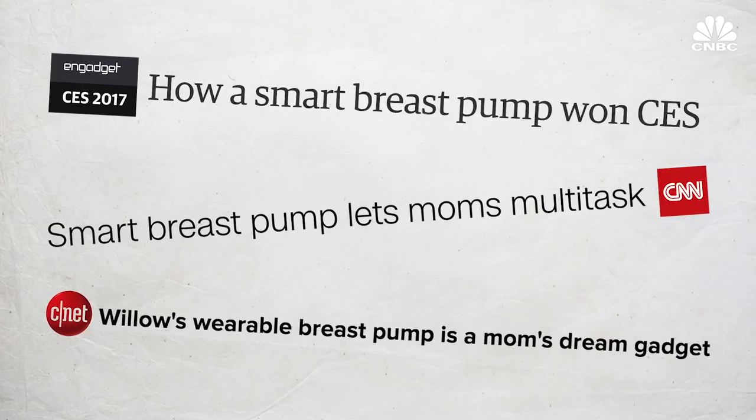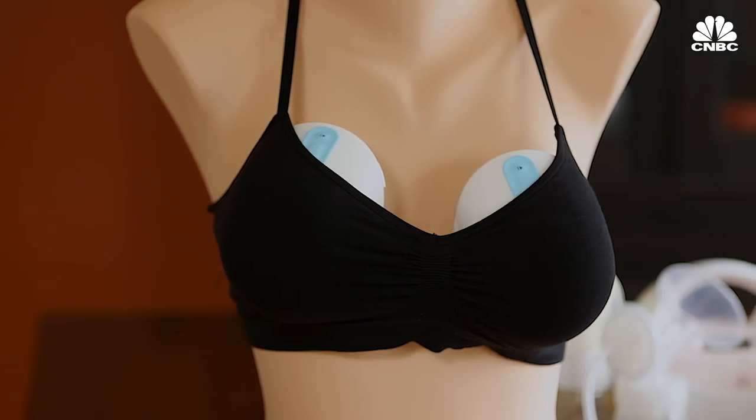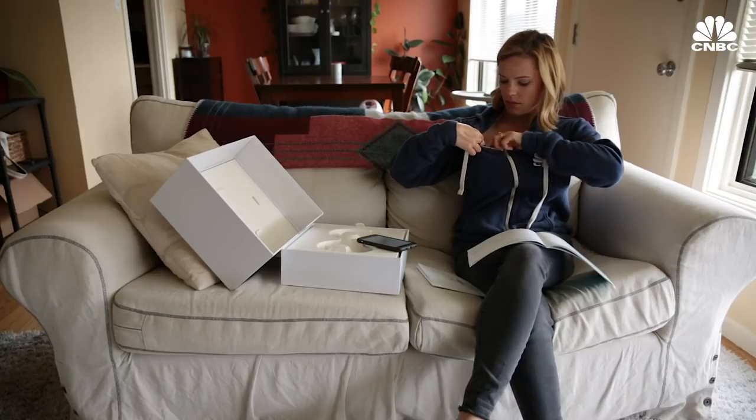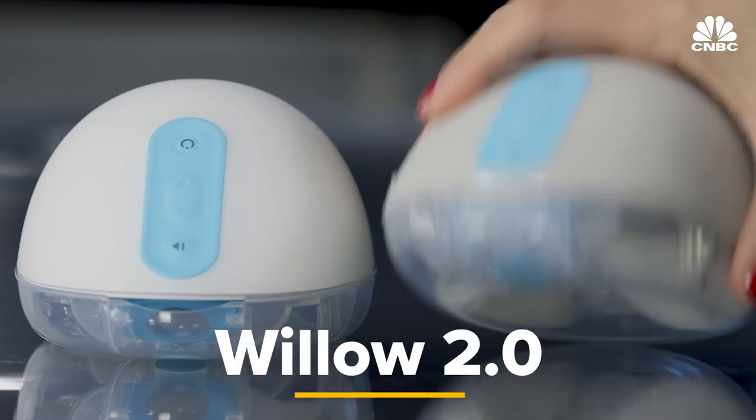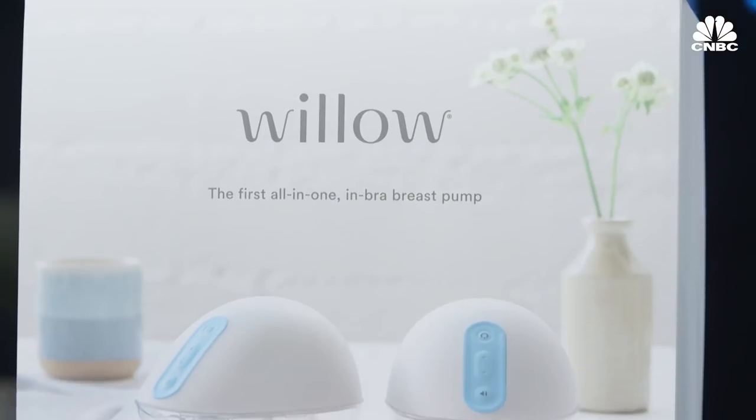The Willow Breast Pump was the most talked about product at CES in 2017 because it was unlike any breast pump ever made before. It's a wearable and hands-free breast pump that fits inside your bra. Today the company unveiled the Willow 2.0, which is an updated and improved version of the original pump.